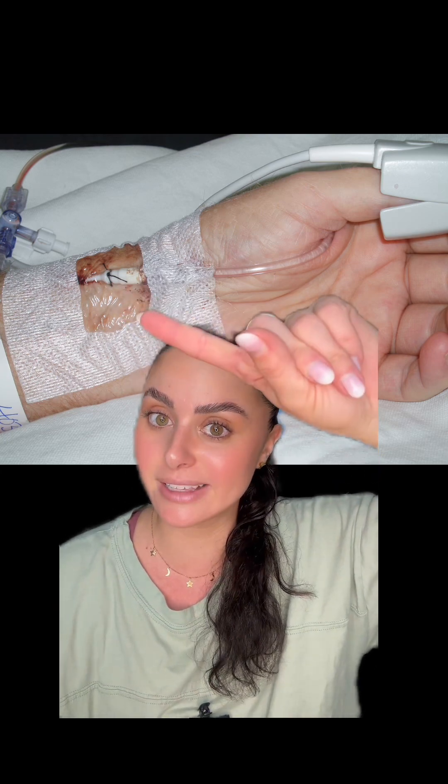Now let's get into the troubleshooting tips. First and foremost, start at your patient. Take a look at the site and make sure there are no kinks, no air or bubbles in the tubing. Arterial lines can look similar to IVs, but a couple of differences: they're often sutured in, and the tubing is pressurized — you won't be able to squeeze it like traditional IV tubing.